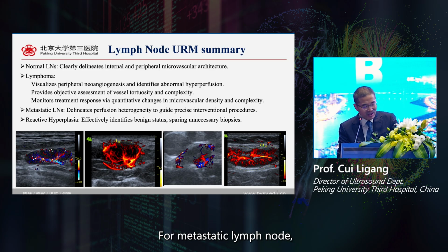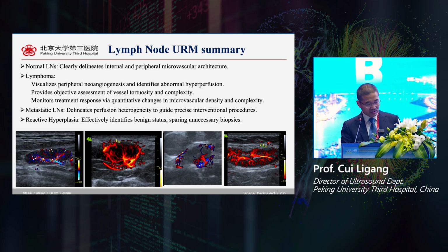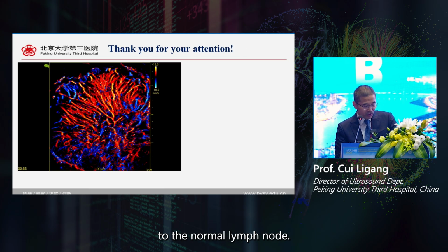For metastatic lymph node, we can describe perfusion differences, and for the reactive one, it looks similar to the normal lymph node.